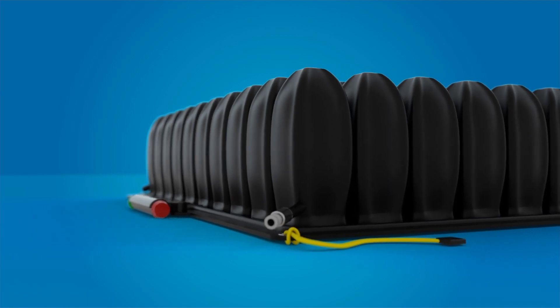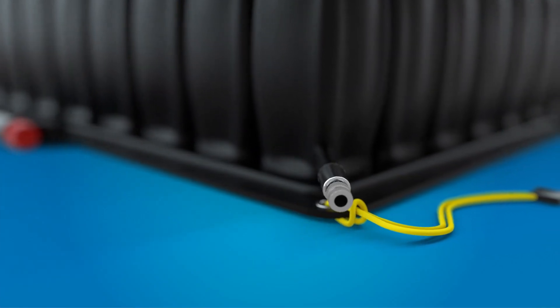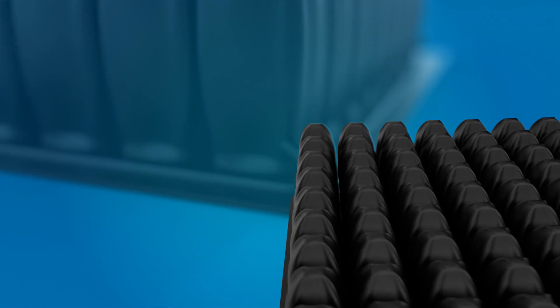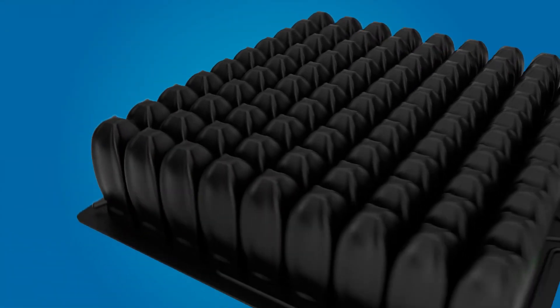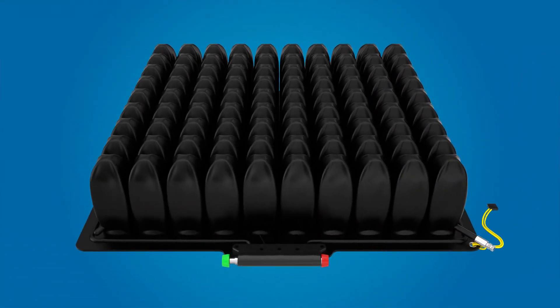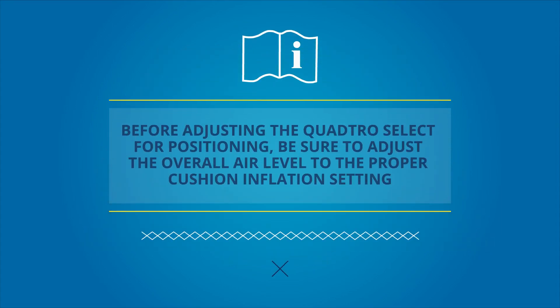Positioning with the ROHO QuadroSelect Cushion. The QuadroSelect Cushion allows for correction or accommodation of lateral and/or anterior-posterior asymmetries of the pelvis and upper legs through adjustment of the inflation level in each quadrant. Before adjusting the QuadroSelect for positioning, be sure to adjust the overall air level to the proper cushion inflation setting.